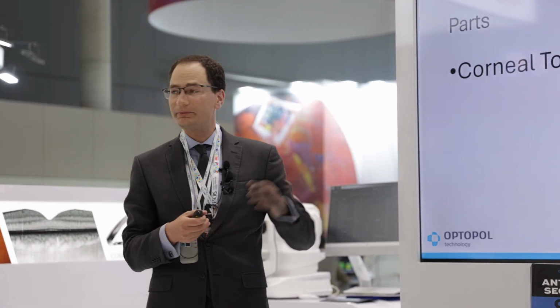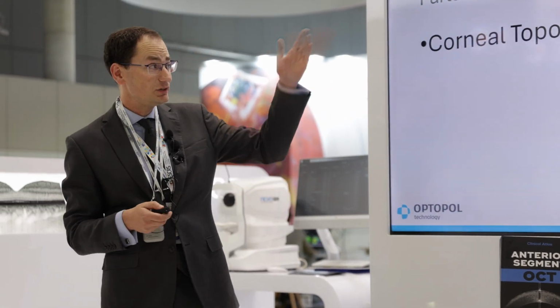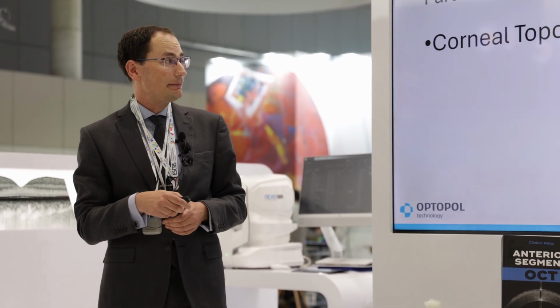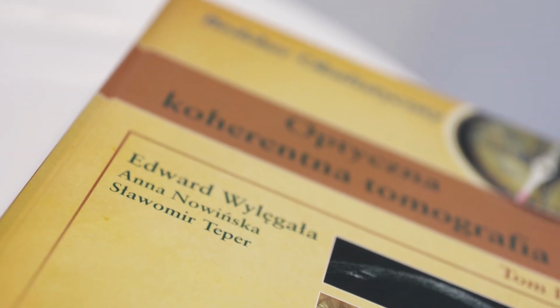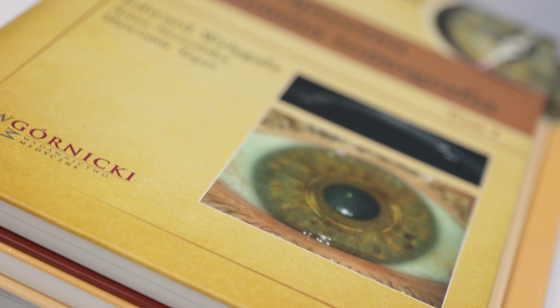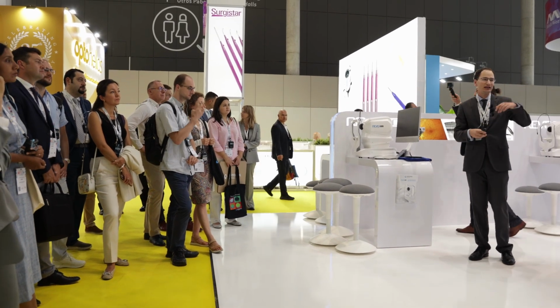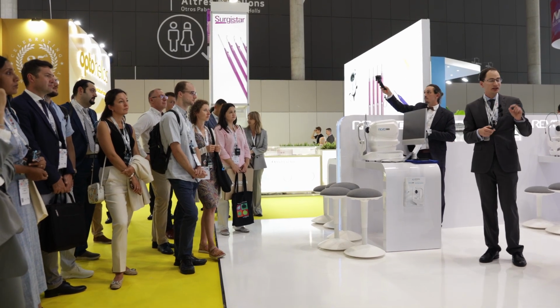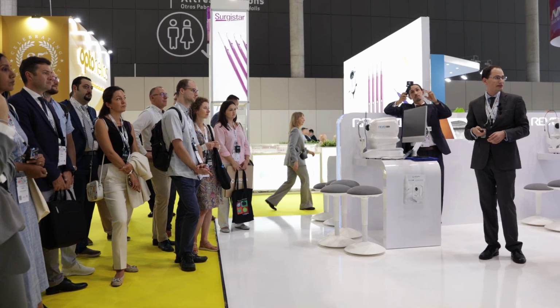So it's naturally based on the type of analysis that you can find on Revo. For instance, here you have the explanation of the different types of keratoconus prediction indices. And then I try to also make it very straightforward in terms of what's coming from where. If you have an elevation in keratoconus, then it's coming to be the corneal thinning within the cone, and then you have this donut shape. So I try to make it very, very approachable.